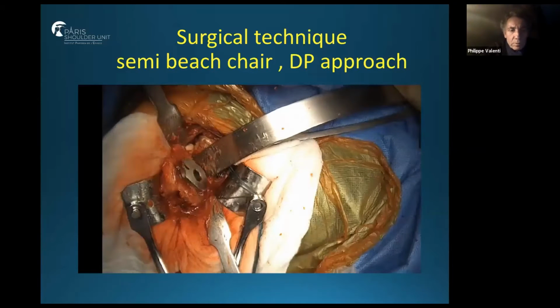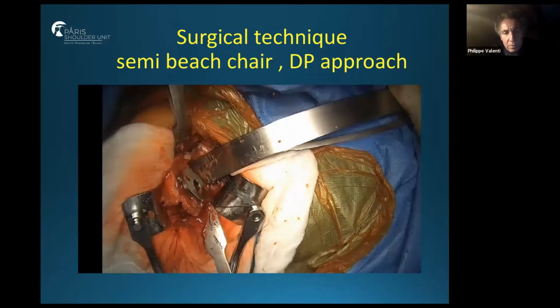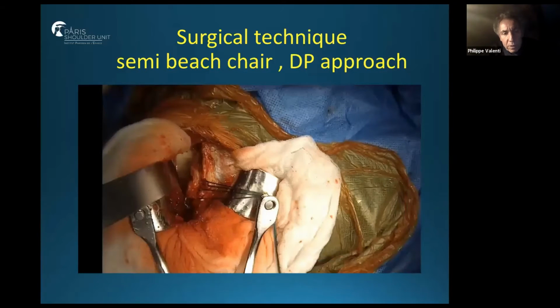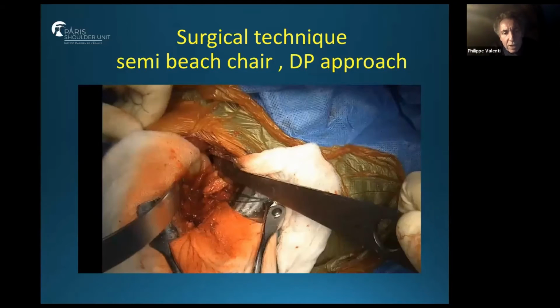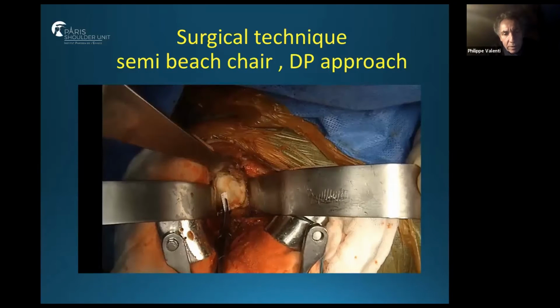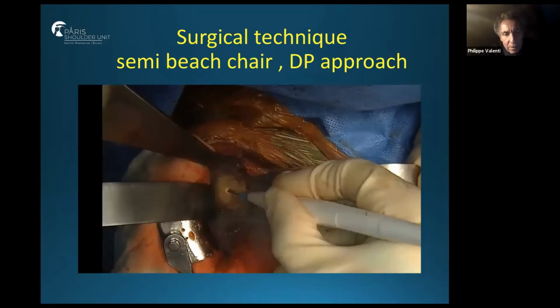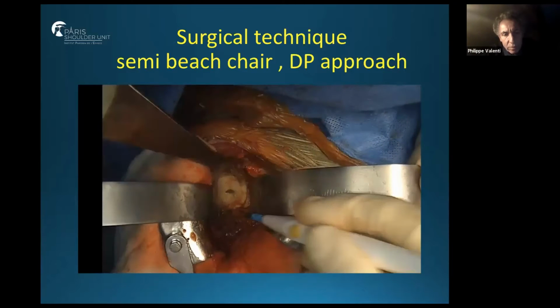After, we do an exposition of the glenoid. We use four retractors: posteriorly, anteriorly, superiorly, and inferiorly. I think that you have to do a large capsulectomy. You resect the labrum and you define the glenoid very well. You see that I measure the distance between the center of the base plate and the inferior part of the glenoid: it is 16 millimeters when we use a 44.